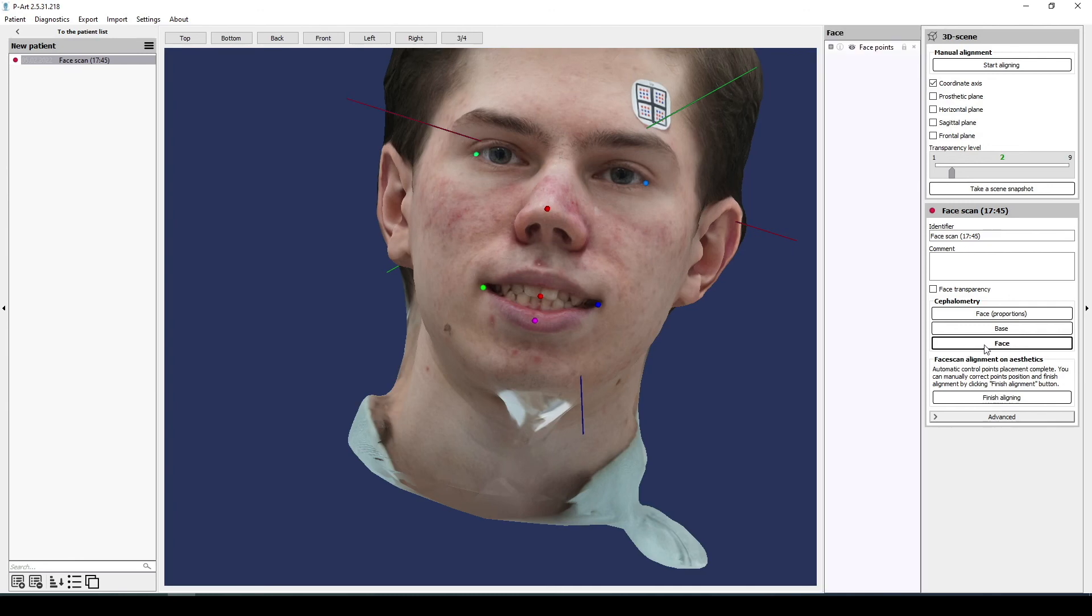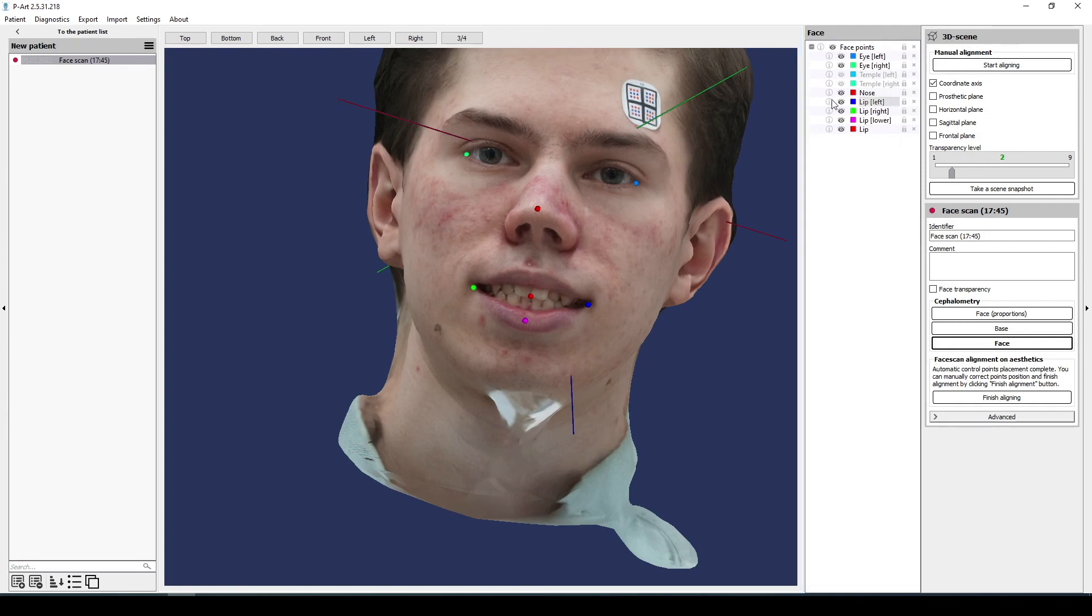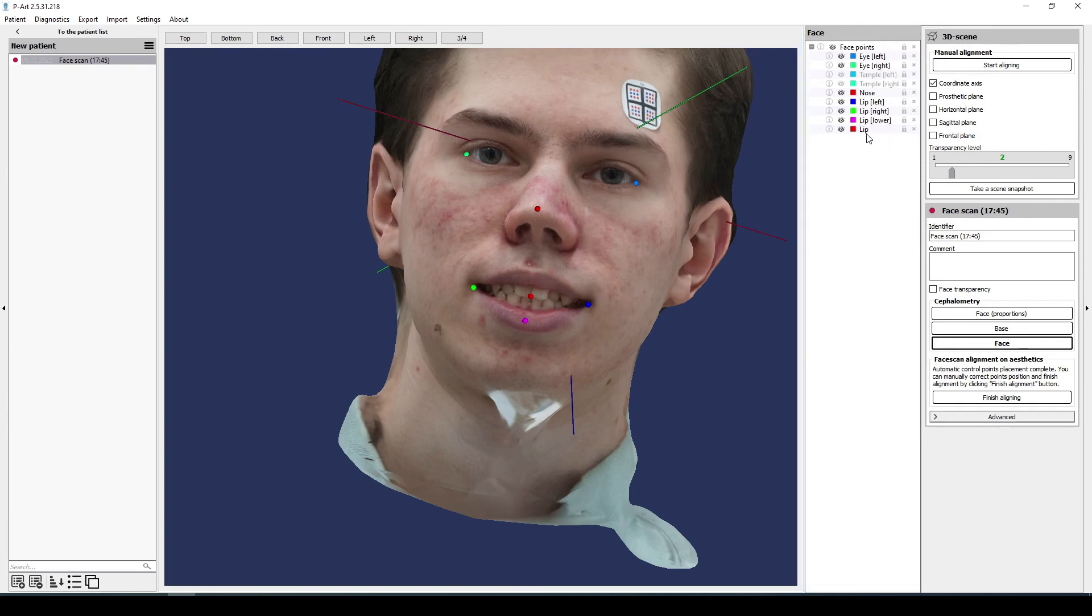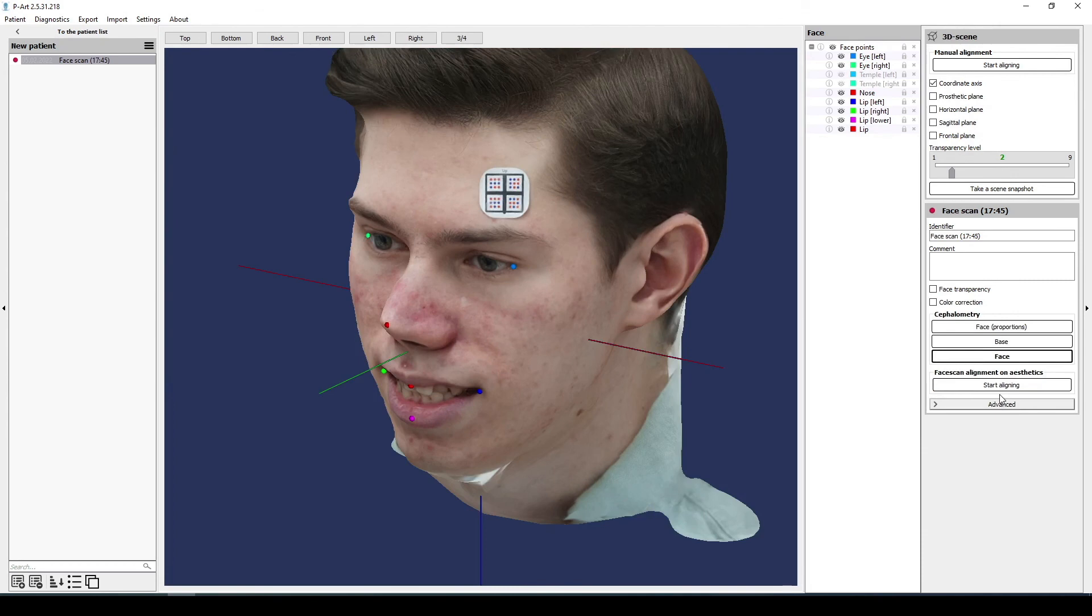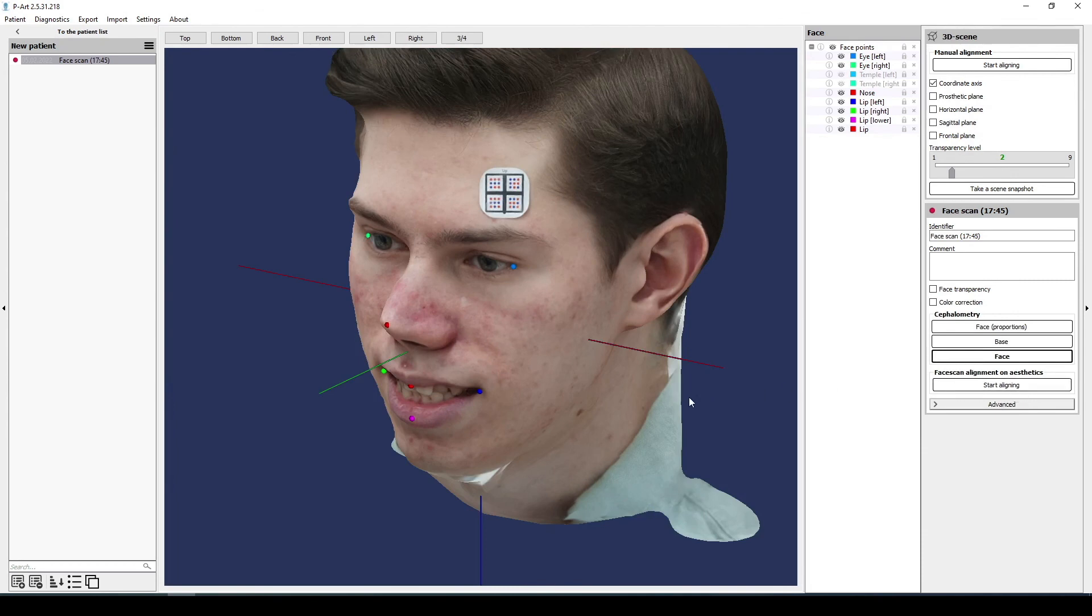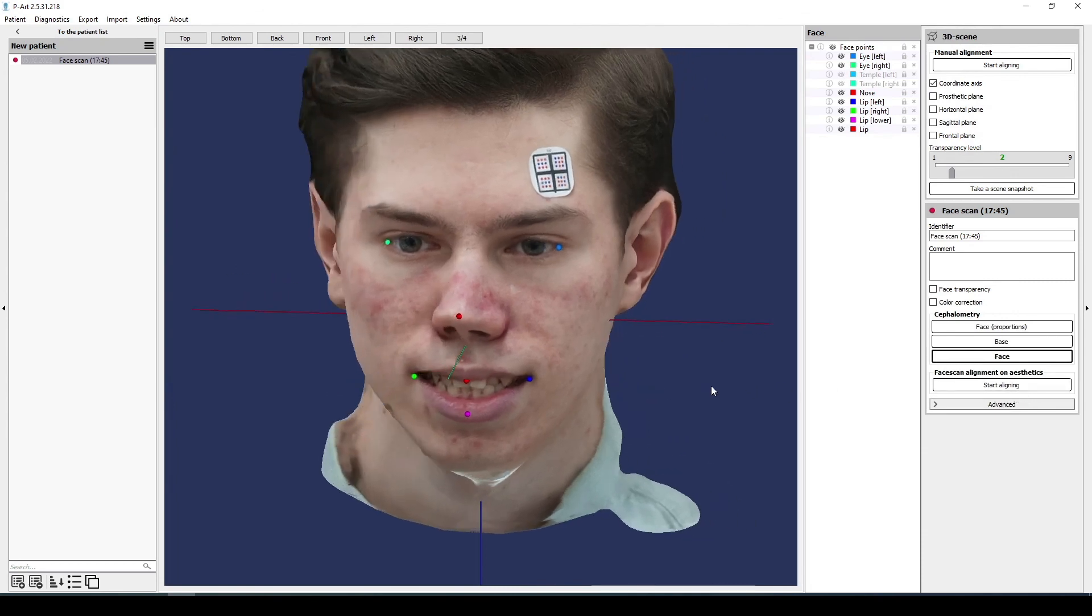In face scan section we find face cephalometry and correct all necessary points or add points. The point, lip, is located on the lip closure line, other points are well placed. And next in the right menu we click complete alignment. The face scan is ready and we can start working. The detailing of the teeth is pretty good.